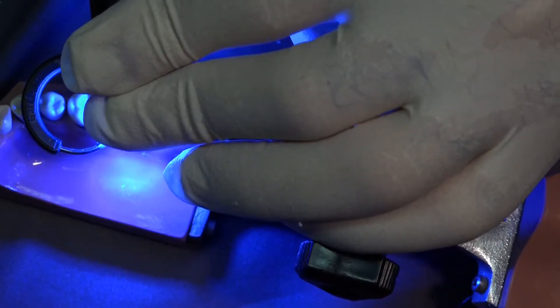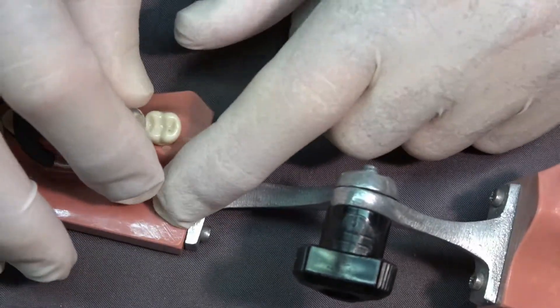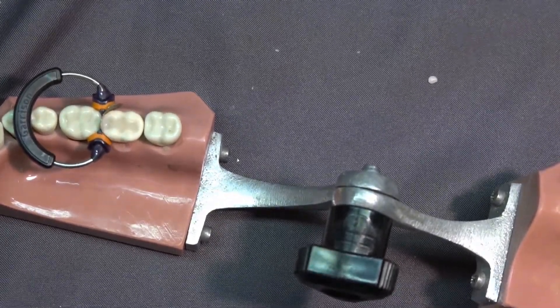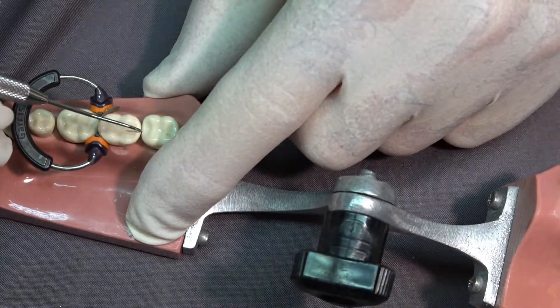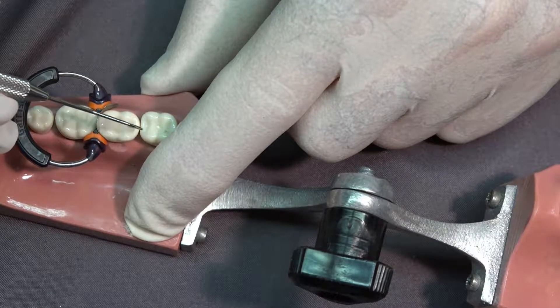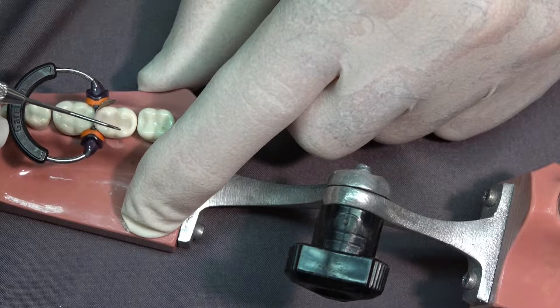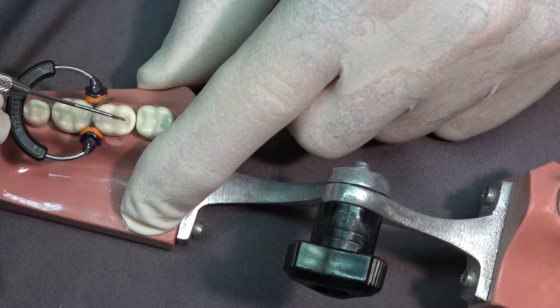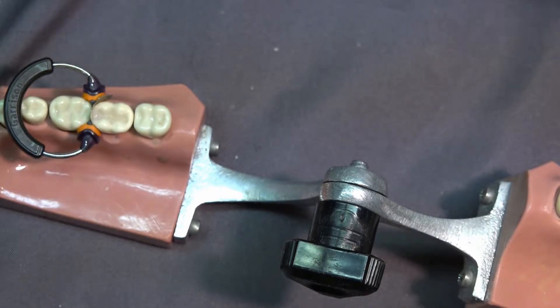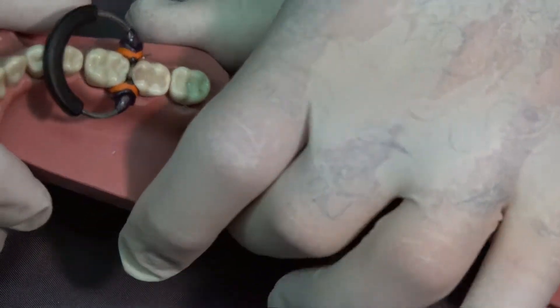Right now it's the proof of the pudding. I'm going to stop the curing and let you see this surface, which is hard and smooth. I'm going to take an explorer, and I hope you can see how hard and smooth this composite is. There might be a little bit of flash there, not much. Notice how the composite flows from tooth to composite with no catch. Now I want you to be able to see what this looks like, so I'm going to try to get a close-up view of this.